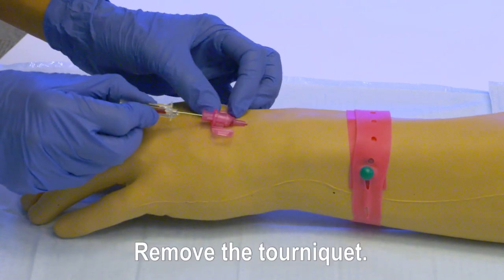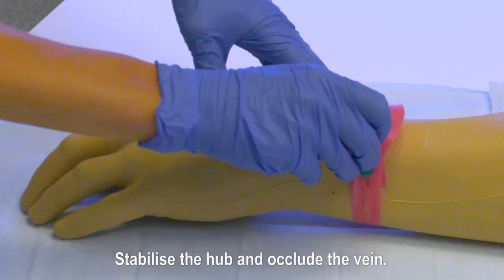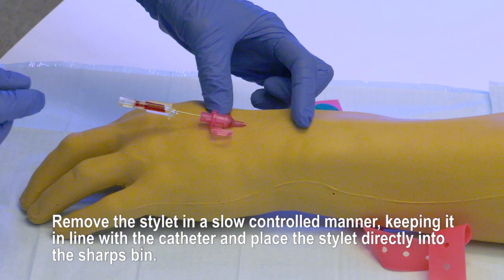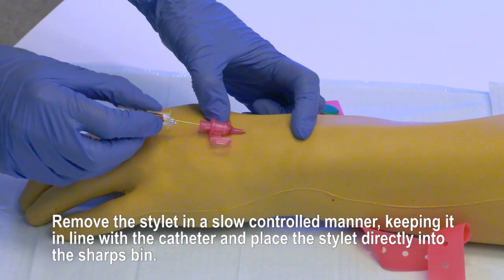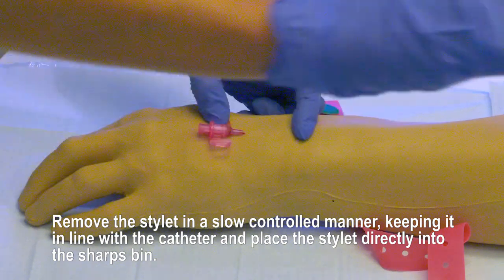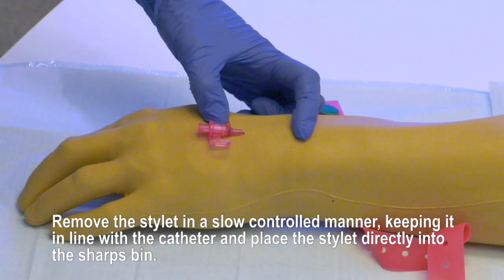Remove the tourniquet. Stabilise the hub and occlude the vein. Remove the stylet in a slow, controlled manner, keeping it in line with the catheter, and place the stylet directly into the sharps bin.